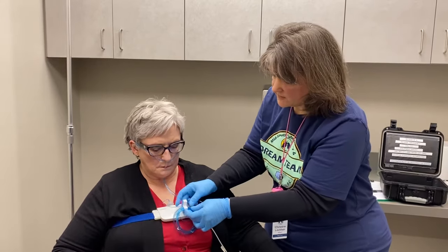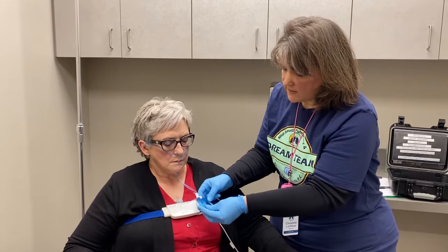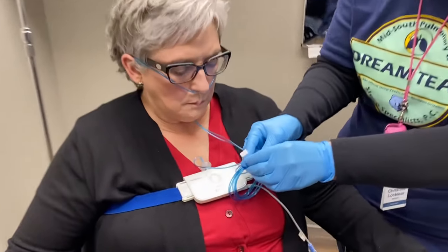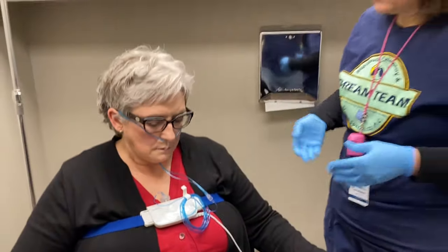Also on the tubing here for the nose piece, there's a little paper wrapped around here. If you want extra slack on the tubing, you can remove that. But if you'd rather just leave it on there, you can do that too — whatever you think would work best.